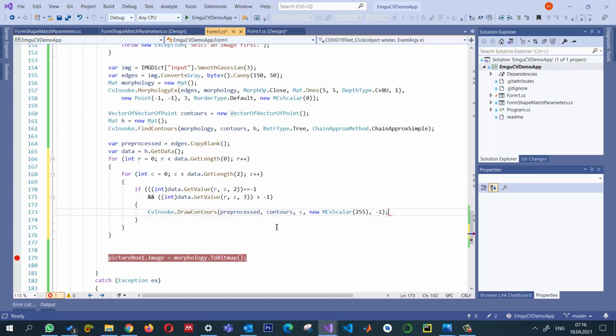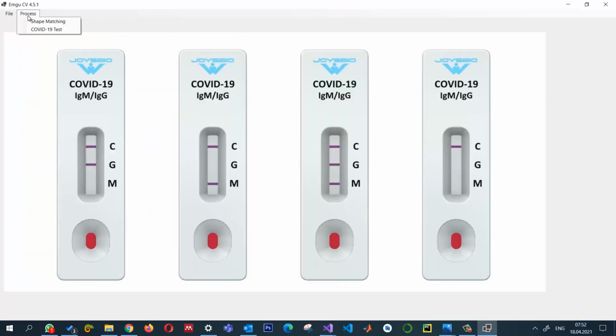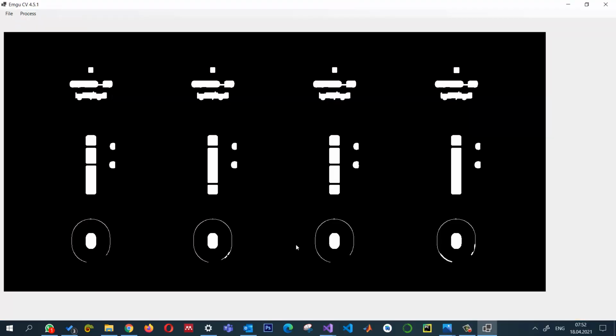By the way, okay, let's see the result after pre-processing, what happens, and then we will take the next step. In fact, it is the second dimension, not the third one. So that is what exactly I wanted. So what I can do now is we need to keep these. I draw the contours, and in fact, the contours which are longer and taller, we can keep them. For example, this is the one that I can ignore easily inside this for loop.